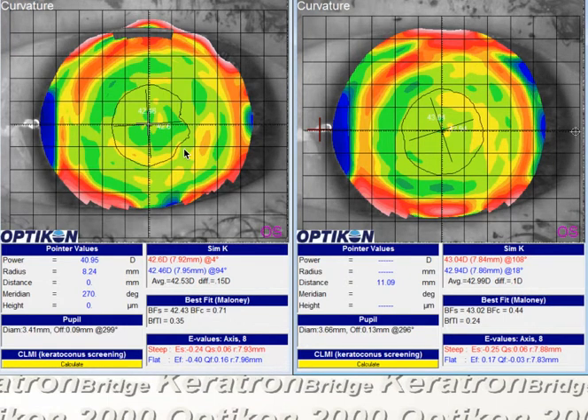This is a hyperopic orthokeratology case on a patient who's had LASIK and is right now a little bit hyperopic. Pre- and post-treatment topographies show minimal change — we're just not getting very much treatment.